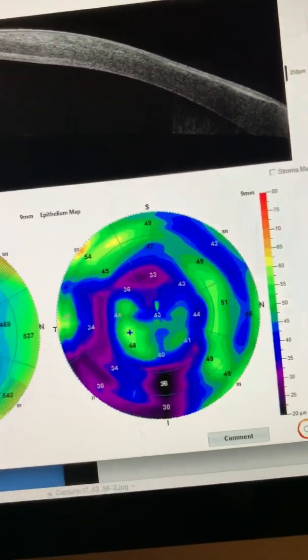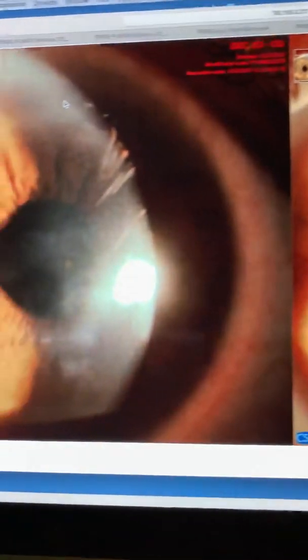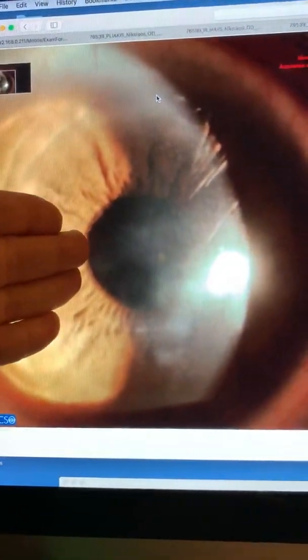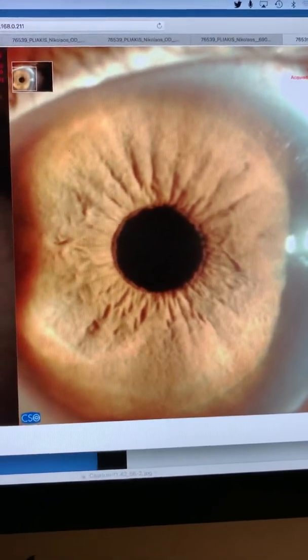And the epithelium is almost remodeled. This should turn all green in order to say that the patient has recovered. Let's look at the external pictures here. We can see this eye with the ground glass appearance of cross-linking, but relatively clear cornea.